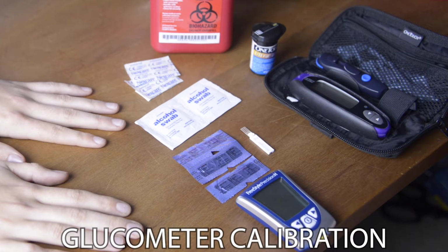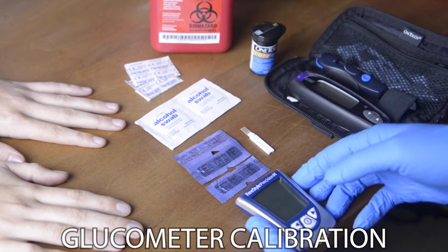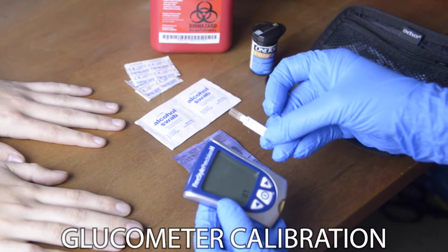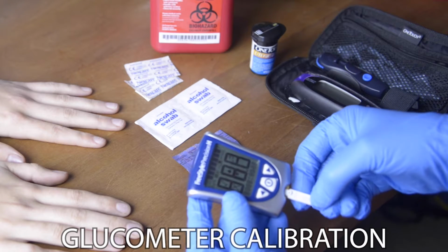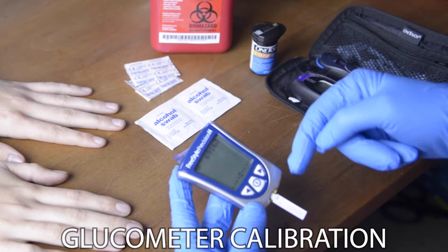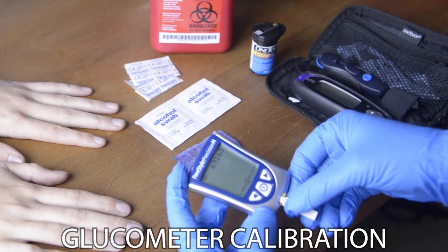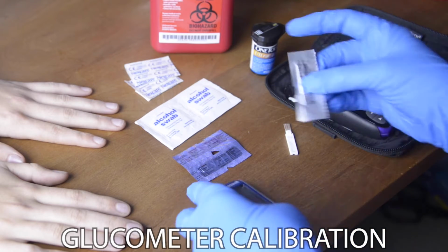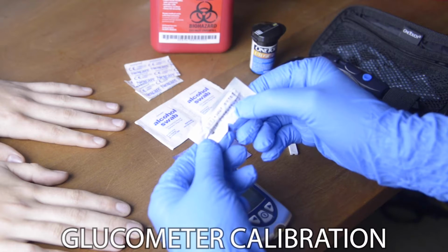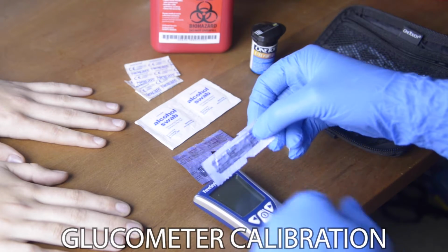So in order to test a blood glucose, if you have a calibration style meter, you need to use a calibration stick, which tells the meter the lot number that your test strips are from. So this one's red, 69163. That means I need to use lot number 69163 within a reasonable expiration of the same type of test strip.